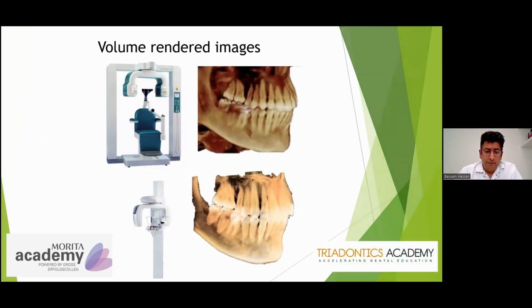I would like to take a moment now to switch to the world of cone beam CT imaging. The picture that you see at the top is the Morita Accuitomo device, the 170, and that was installed, I think, in 2007 at the department where I was working in Amsterdam.